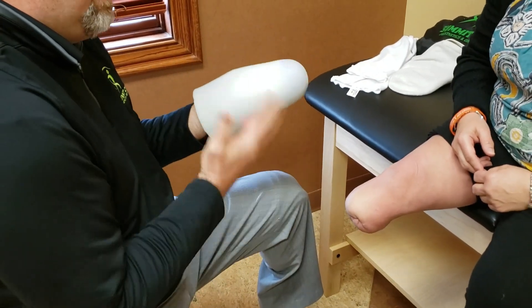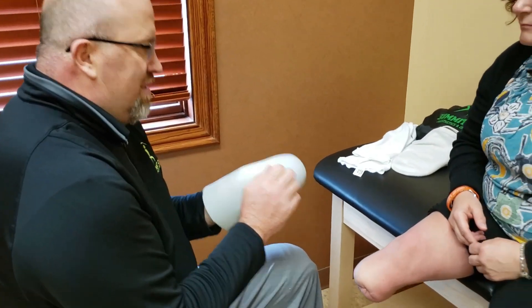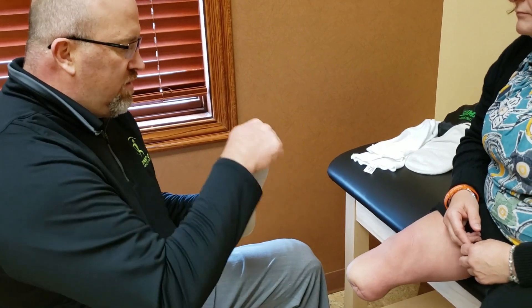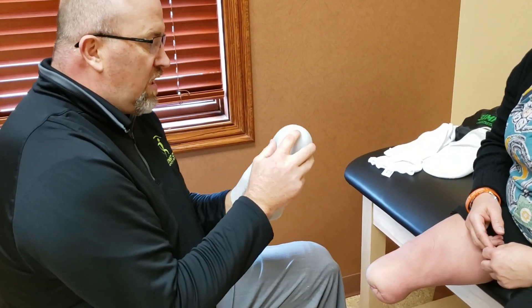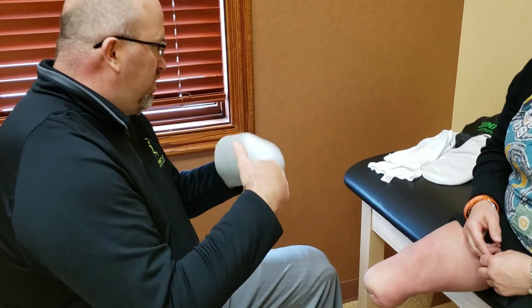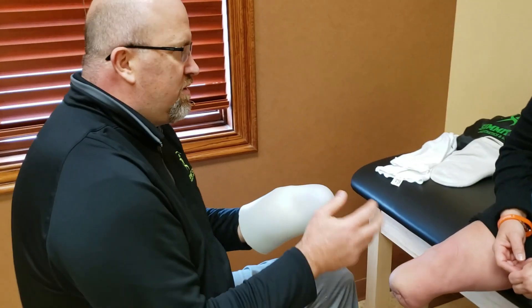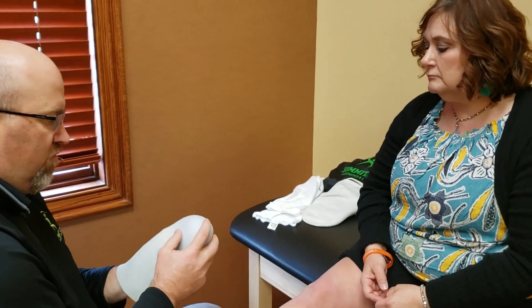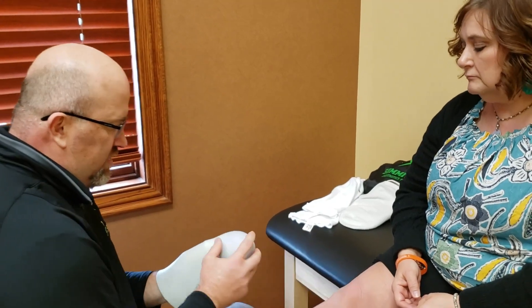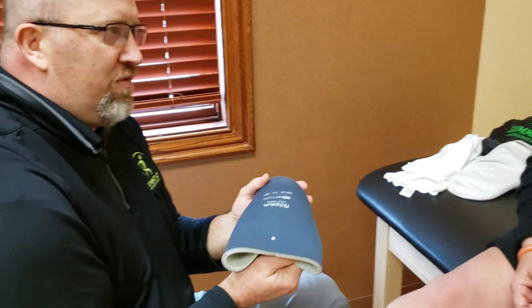Patients get in the habit of taking the liner off, leaving it inverted, and leaving it over their prosthesis or bedside. One negative is the liner can break down easier with the gel material. Secondarily, if it rolls off and picks up anything from the ground — bacteria, pet hair, you name it — this material is fairly tacky and will lay that right against the skin. So again, whether it's on you or off you: fabric out.